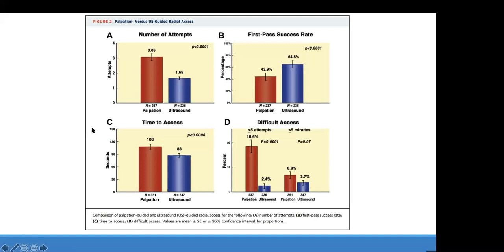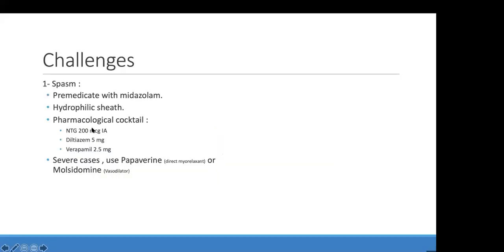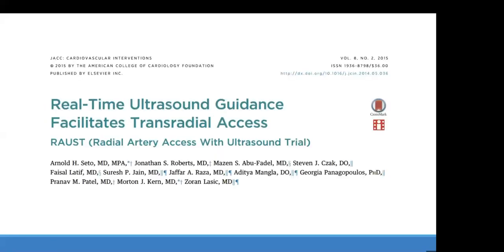Going back, okay, ultrasound. As I said, ultrasound is useful, especially when I really want to do radial, and I'm sure all of you are comfortable with ultrasound. And the way to confirm, if you're in doubt whether this is a vein or an artery, you can just put a Doppler, and if it's an arterial Doppler, then for sure it's radial, and you can wire it.